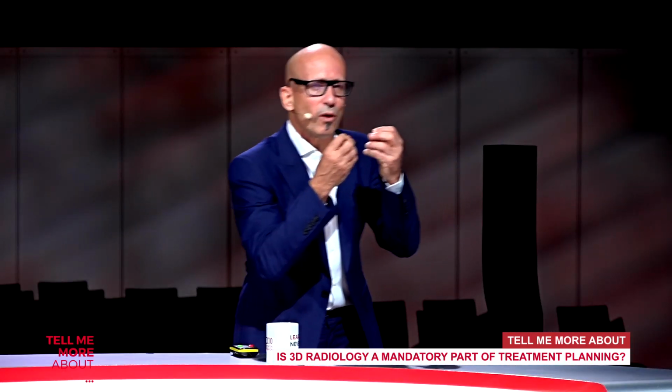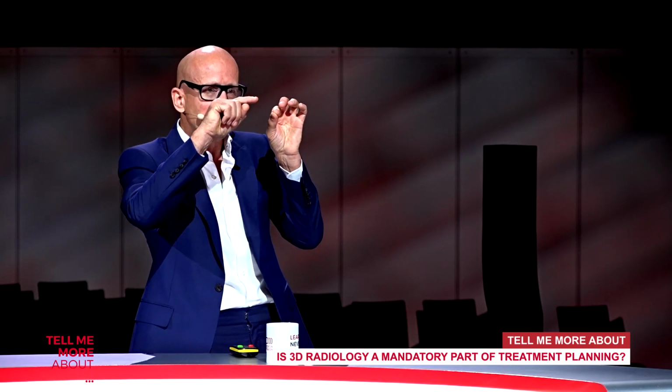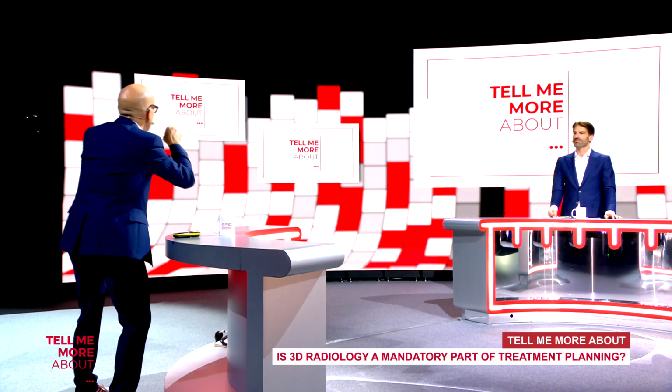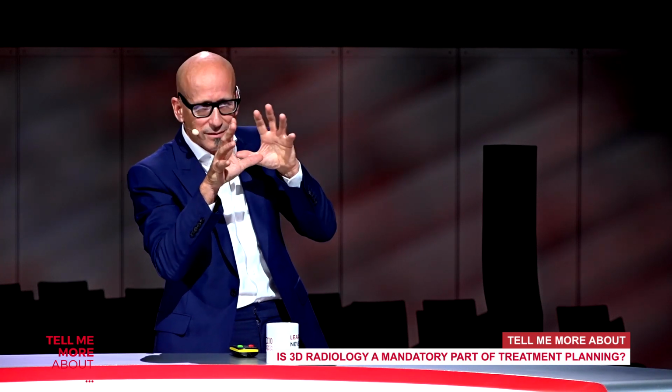What does the bone look like on the 3D picture? What kind of quality of bone may be there? Where is a little bit more dense bone? And for instance, I can look at the top, three-dimensionally, where my first bore goes in. Is it exactly there where I planned it? Then I look, and that's what may help me. Yes, I'm there. I'm good. And so I need the 3D radiograph when I do this.